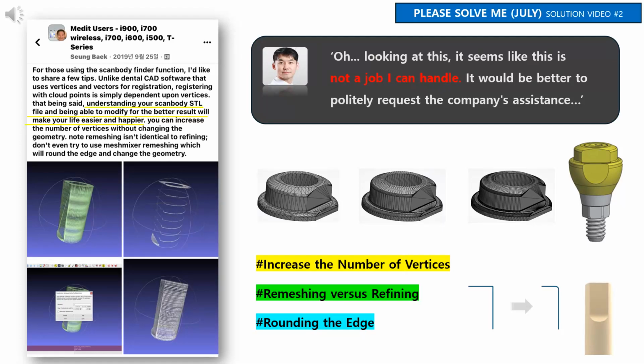He introduced how understanding and modifying the scanbody library we use can improve results and make our lives easier and happier. Dr. Zhang wanted to learn the great task of optimizing scanbodies and has been working on it for the past few years, but eventually realized that it is not an easy task. Therefore, currently, if a newly adopted scanbody does not work well within the scan program, he requests modifications through thorough discussions with the scanbody manufacturer's technicians.